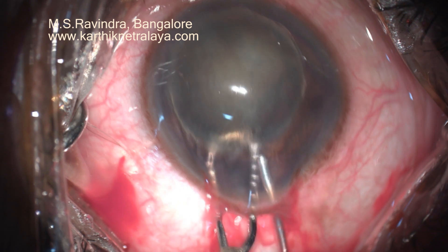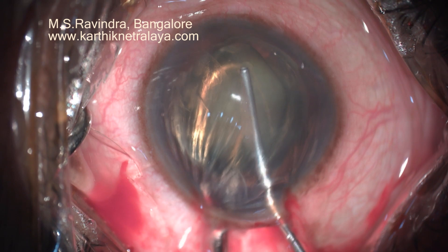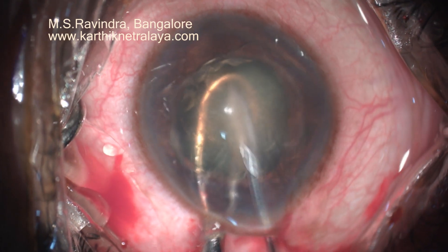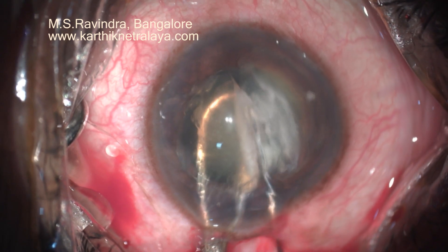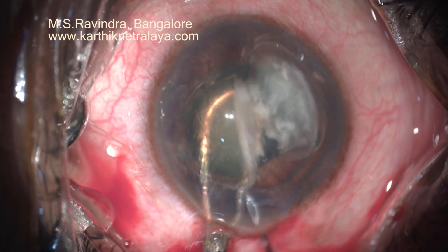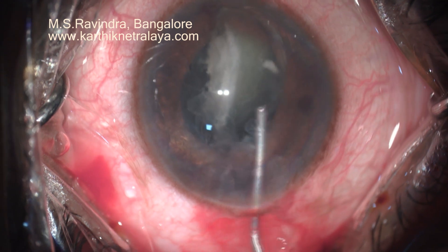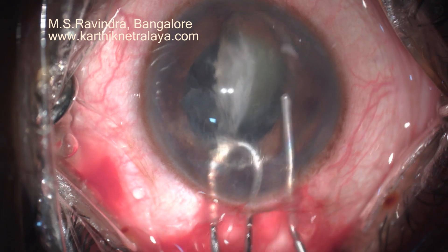So I try to bisect the nucleus with my routine technique of bisecting with a shaft of 25 gauge cannula. It is not cutting through, so I am using a cystitome to complete the bisection, ensuring that the two halves are totally separated. I am removing the hemi nuclei one after another, impaling the cystitome into the nucleus so that it helps me in visco-expressing it. The other half is also expressed similarly.